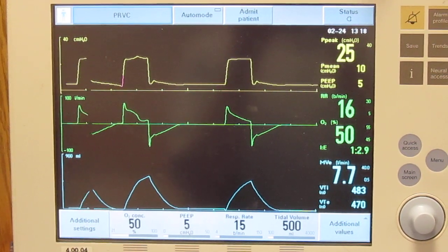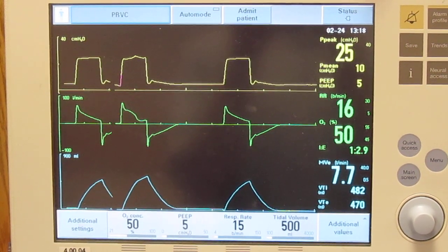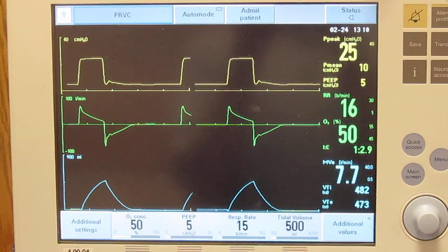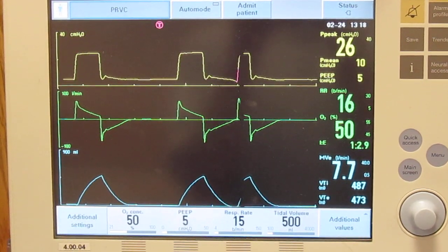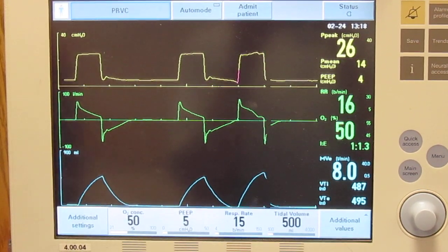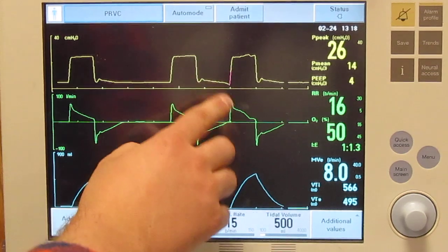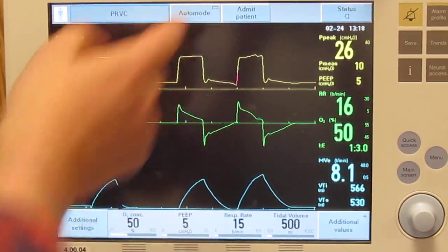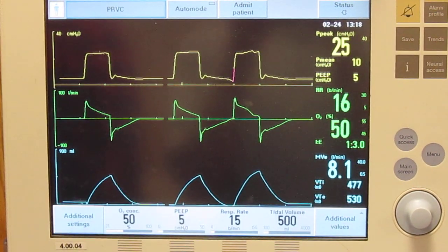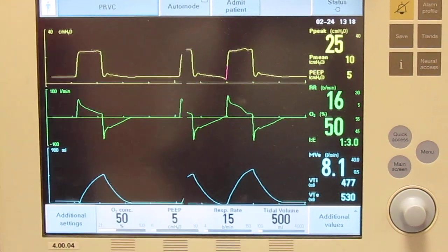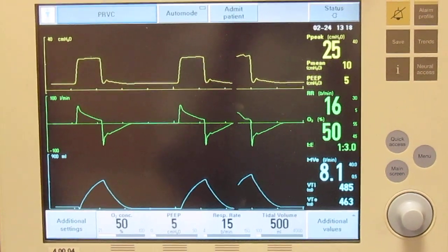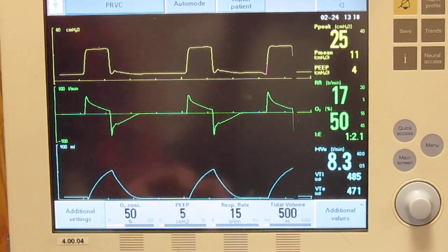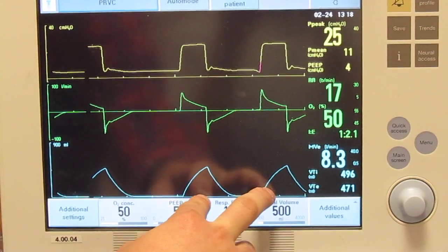We'll do it one more time, right after this breath. You see a little drop — the negative two effort — and then it gave a breath. The volume at the bottom should be the same. And yes, the volume is the same.